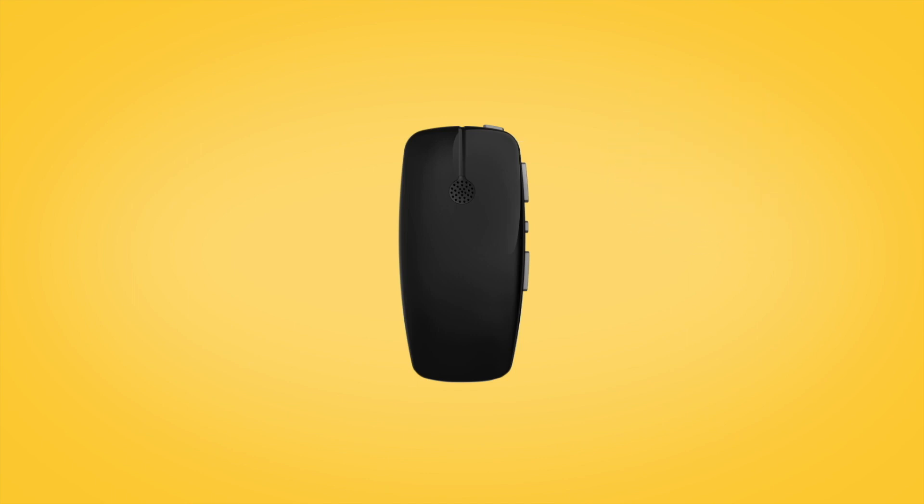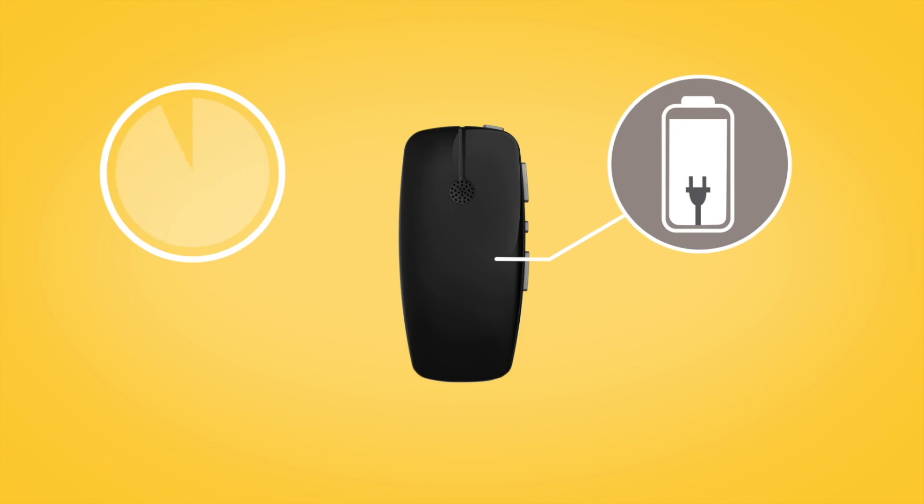Before using your Mini Microphone for the first time, make sure it has been charged for at least three hours, even if the light indicates a full charge.